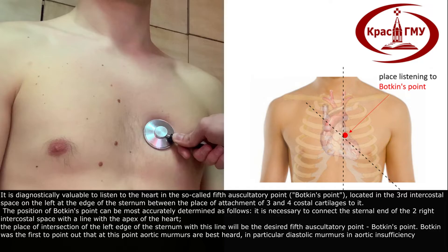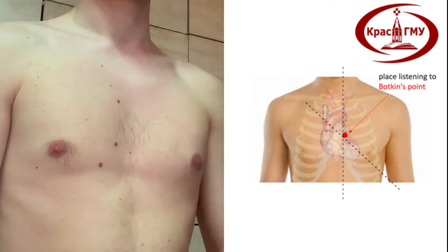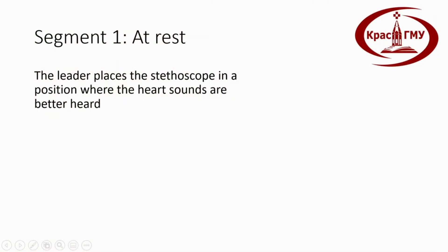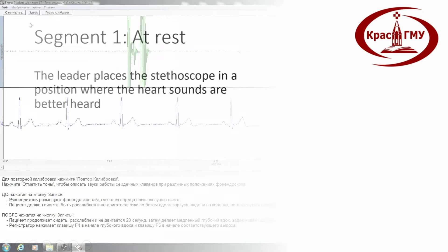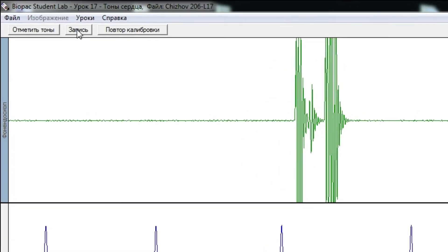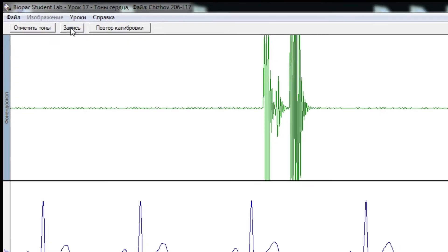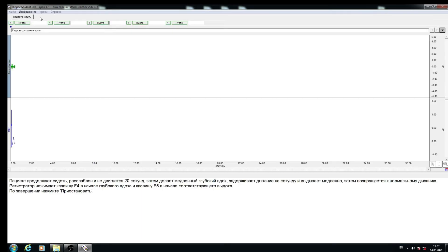Botkin was the first to point out that at this point aortic murmurs are best heard — in particular diastolic murmurs in aortic insufficiency. Segment one — at rest: the leader places the stethoscope where heart sounds are best heard. The recorder clicks Record to start recording; the 'at rest' marker will be set automatically. The patient must breathe calmly for 20 seconds.